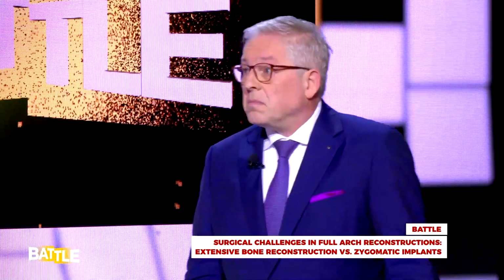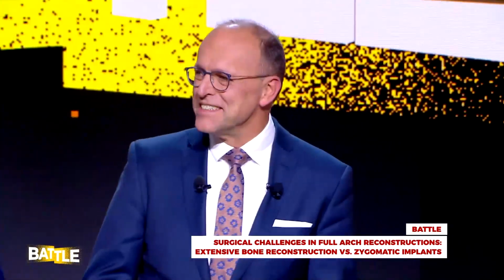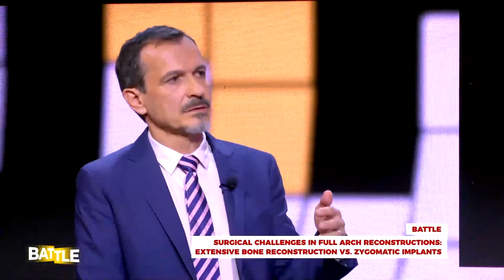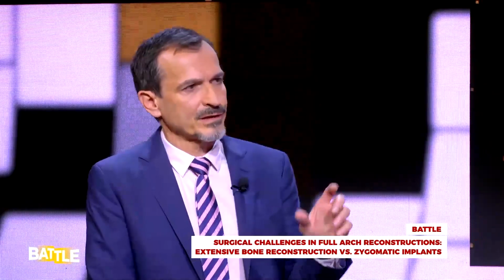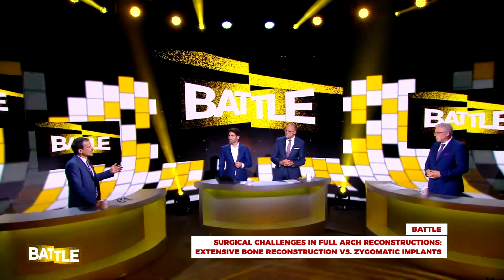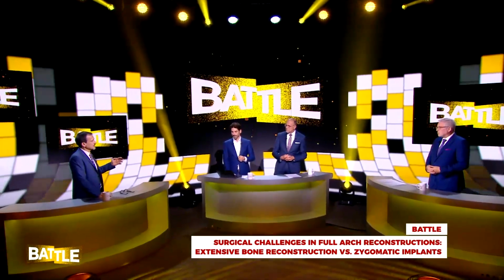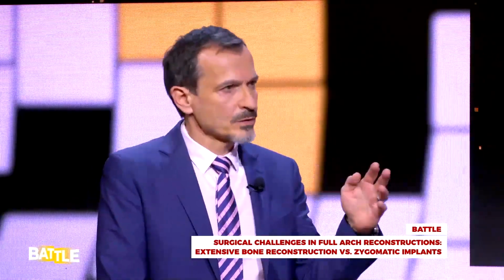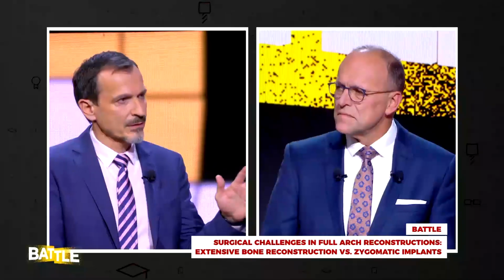So Dennis, would that be a case for your approach? It depends a little bit on the situation of the patient, of course. If the patient is 60 or even younger, then I would even go with the fibula case. That means I would try to reconstruct the height and the width of the alveolar crest with a free fibula graft. But of course, you can also combine these. Let's say we find some bone in some areas and place 3 zygoma implants and 1 standard implant, or 2 zygoma implants and 2 standard implants.